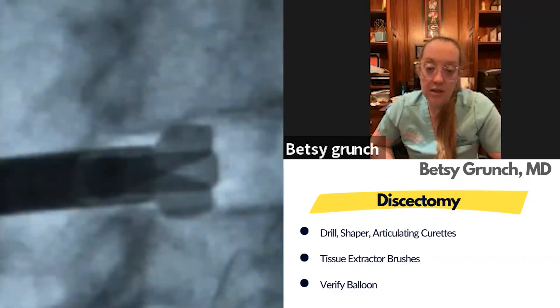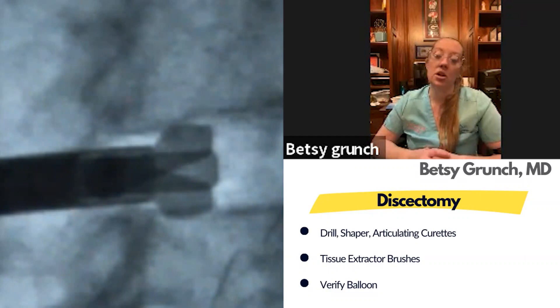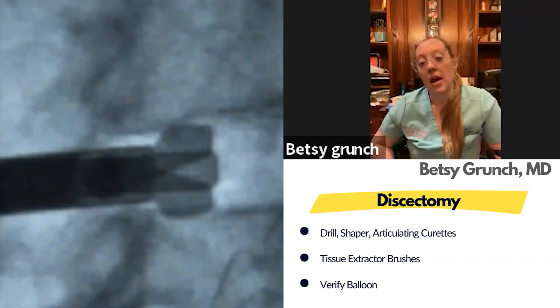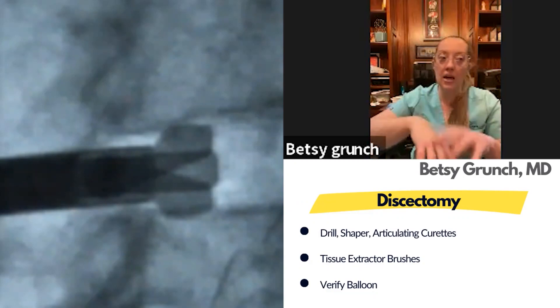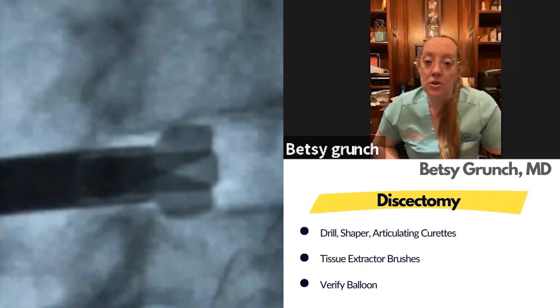The next step is typically the shaper, which goes in at seven millimeters and then you slowly dial it up — very similar to how a TLIF shaper looks. It'll slowly open up and you can spin it clockwise to morselize the disc space. You can open it to size and there's good tactile feel when it's peeling that cartilaginous end plate off. In a normal disc with convexity at the center, you can open a little more in the middle to really decorticate the center of the disc.